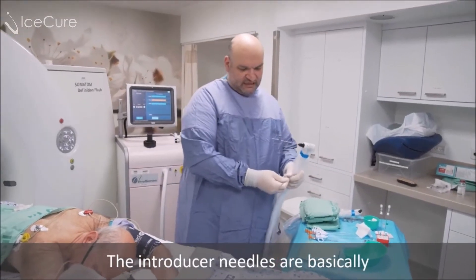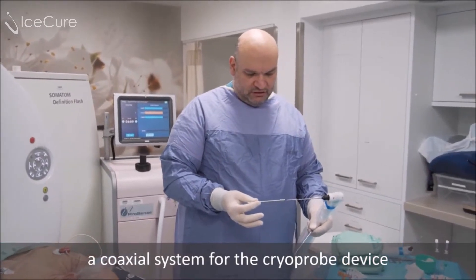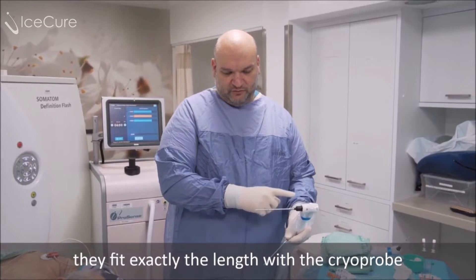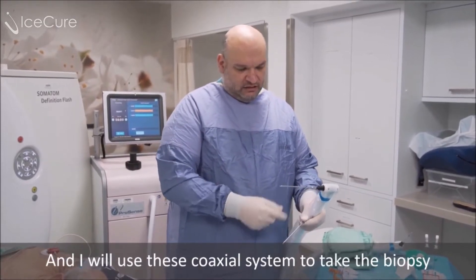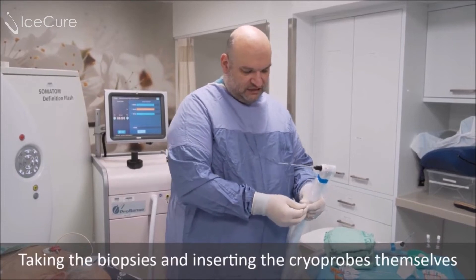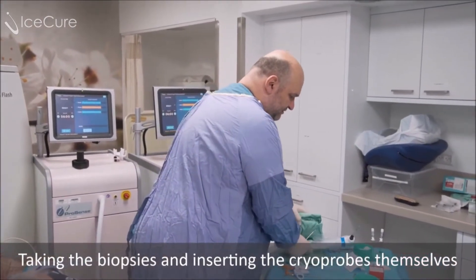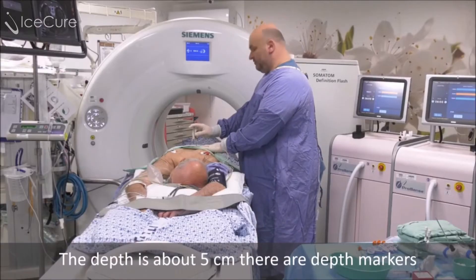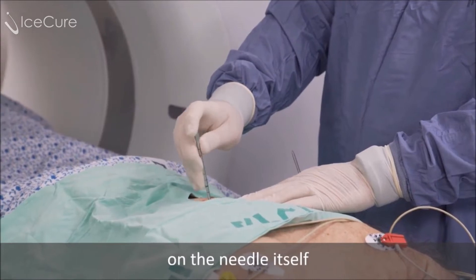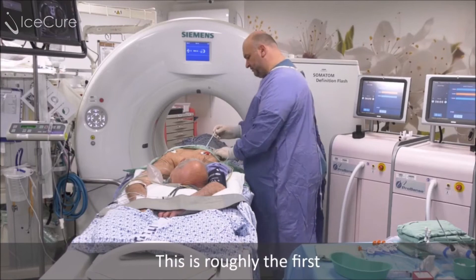Introducer needles are basically a coaxial system for the cryoprobe device. They fit exactly in length with the cryoprobe, and I will use these coaxial systems to aid in taking the biopsies and then inserting the cryoprobes themselves. The depth is about five centimeters, and there are depth markers on the needle itself.